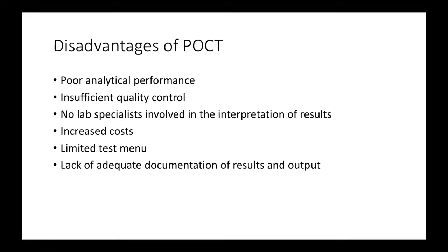But there are certain limitations of point of care testing. Sometimes the analytical performance is not very good. These tests are performed by people working in various capacities: nurses, residents, doctors, other staff. It is very difficult to control the quality.